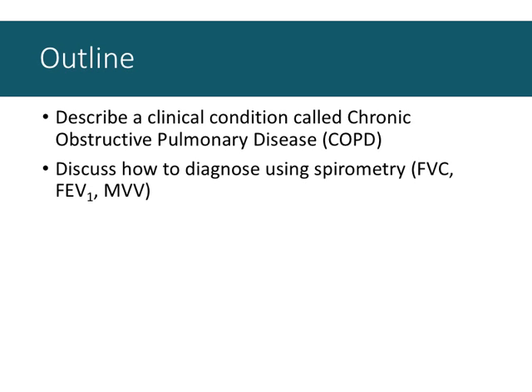We'll take a look at how we diagnose COPD and other respiratory conditions using spirometry that you will use in lab. You've probably done something like this before, but rather than using the fixed mechanical bell spirometers like I think you used in anatomy and physiology, we're using the METCART, which is maybe not any more accurate, but nicer, in that you don't have to breathe out of that contained space with who knows how many bacterial cultures. So we're going to talk about how we use these things.